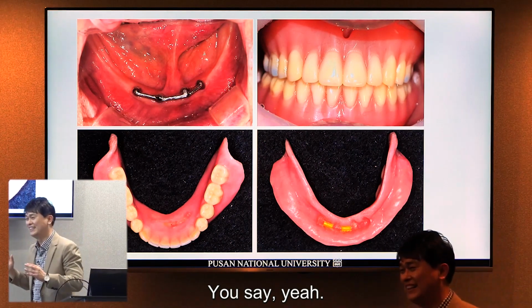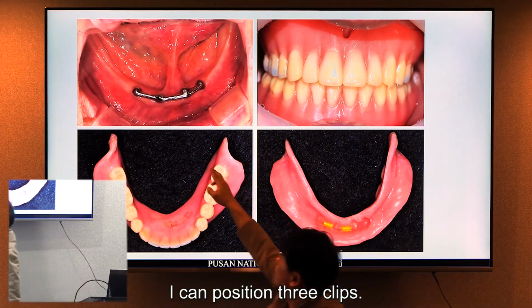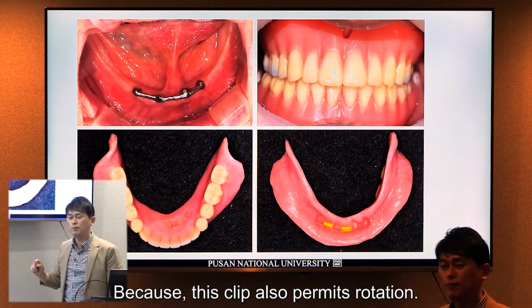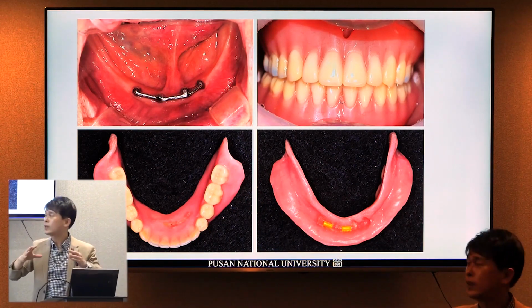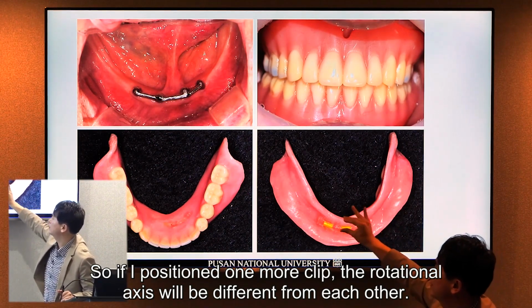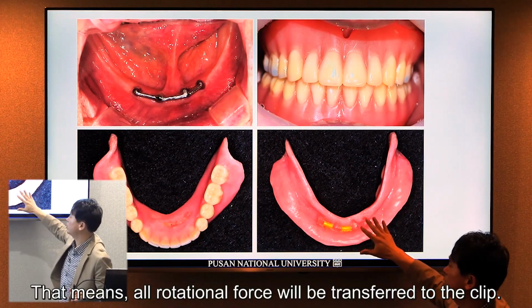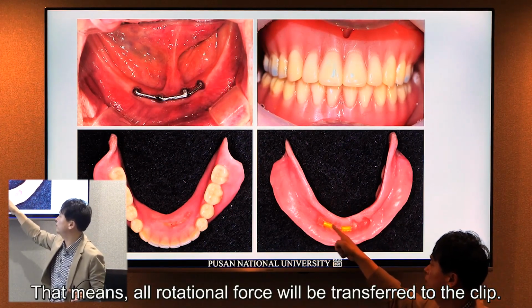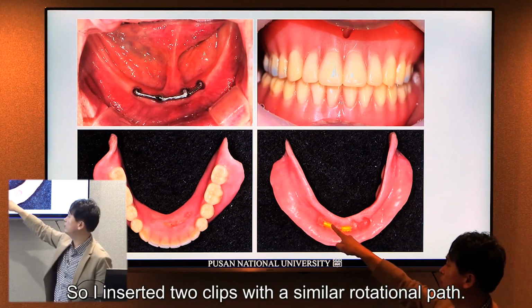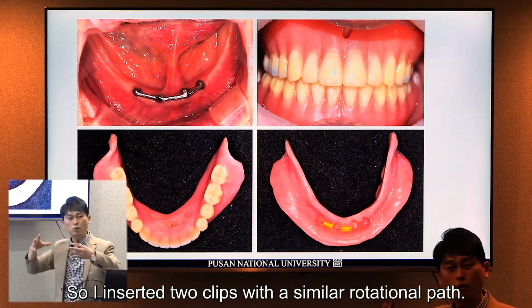You say, yeah. So why did I use only 2 clips? I could position 3 clips, because this clip also permits rotation. But if I positioned one more clip, the rotational axes would be different from each other. That means every rotational force would be transferred to the clip, and the clip wear would be severe. So I inserted only two clips with a similar rotational path.